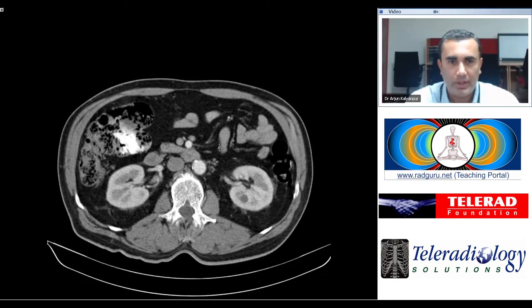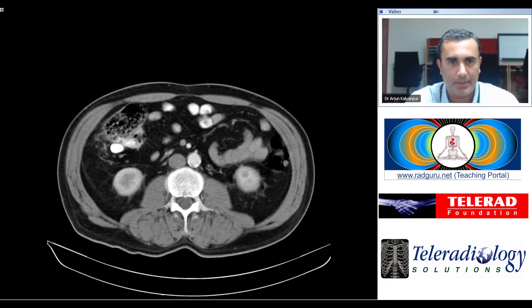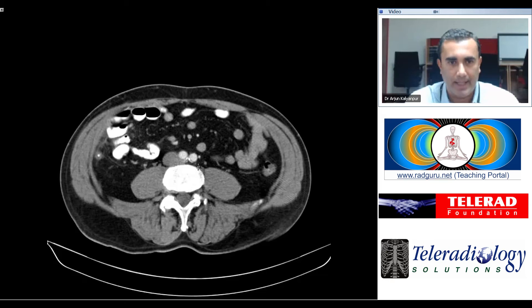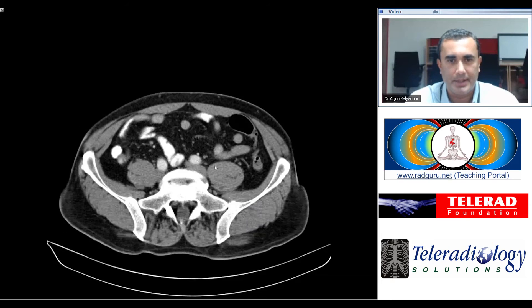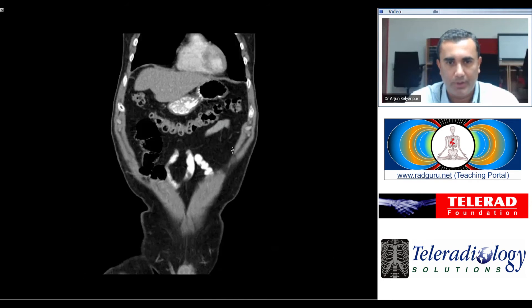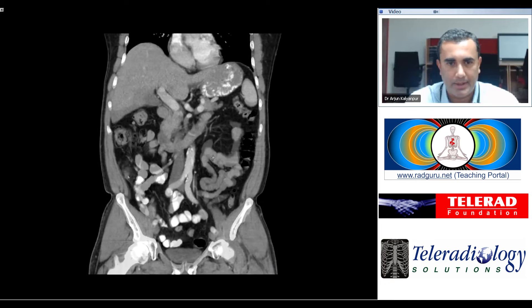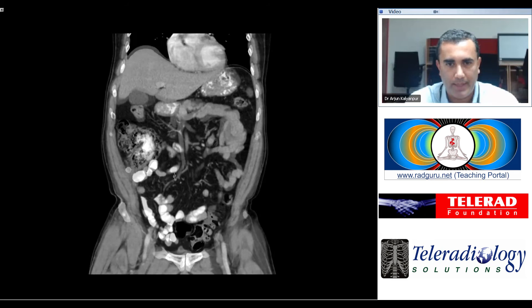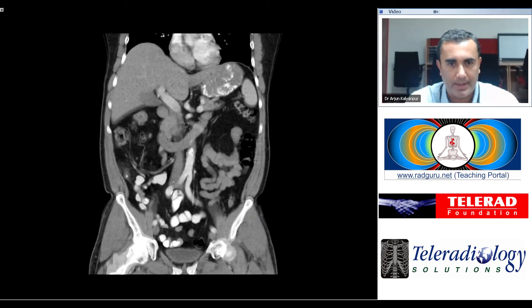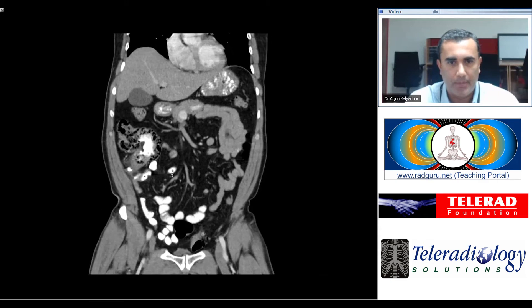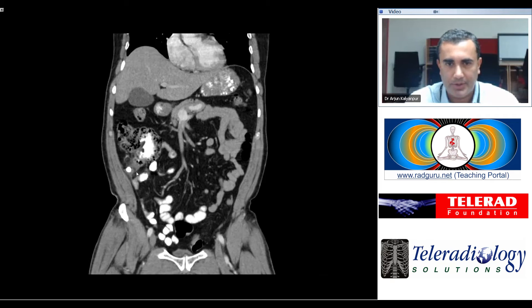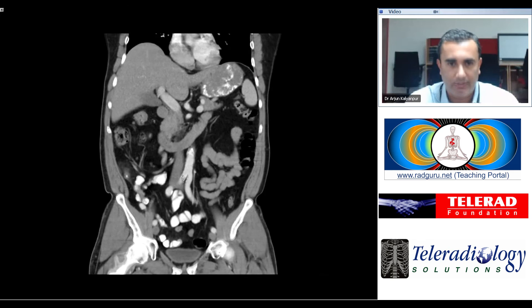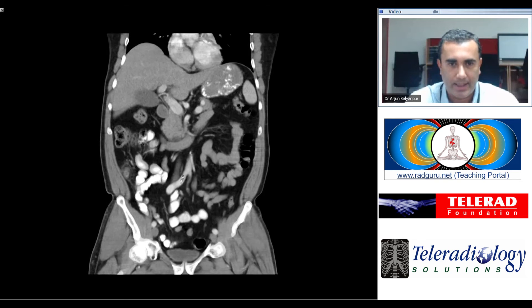The clues for stump appendicitis are the fact that the appendix looks extremely short in length. We can see on the reformats that it is indeed quite short. The cecum is high up in the right flank, which is why the appendix is high in location. The appendicolith visible at the base of the appendix has caused the current inflammation, and there is a second appendicolith at the appendiceal tip.